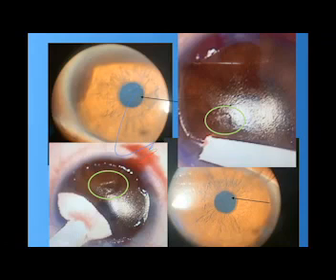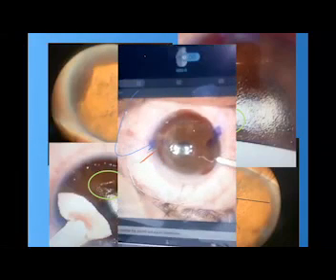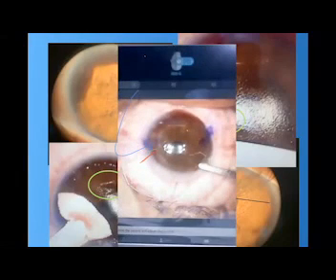This is the point of scarring in this part of the superior stroma, and this point explains the thinnest, explains the steep, explains the shifting of all the figures, ups and downs. So this is the flap, and this is the bed showing these scars or after-scars. So all the irregularities are explained now, and I could go for refractive surgery. This is the flap.